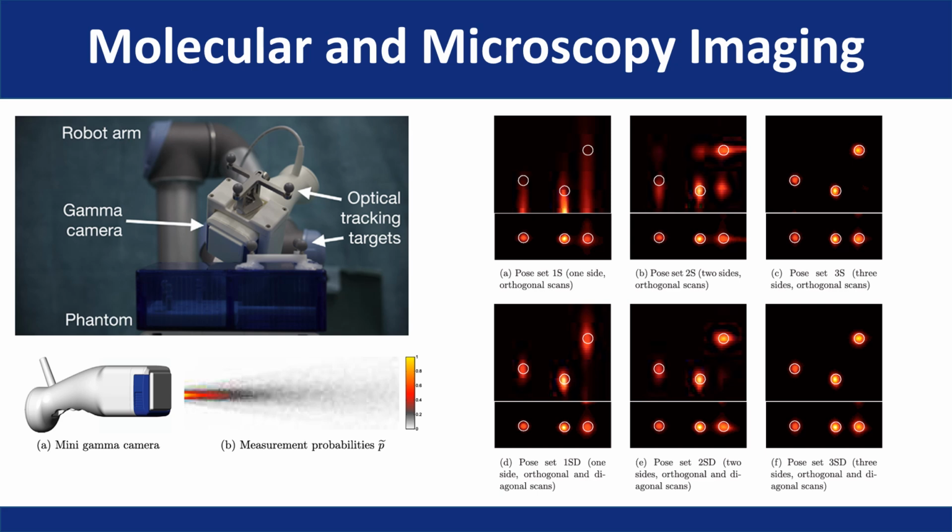Reconstruction results. This figure presents the reconstructed imaging results. The top row shows projection along the z-axis, while the bottom row shows the y-axis, each image highlighting the location of radioactive hotspots within the phantom. The white circles overlay the ground truth location of the radioactive spheres, while demonstrating the system's ability to reconstruct hotspots with high spatial accuracy and minimal artifacts.